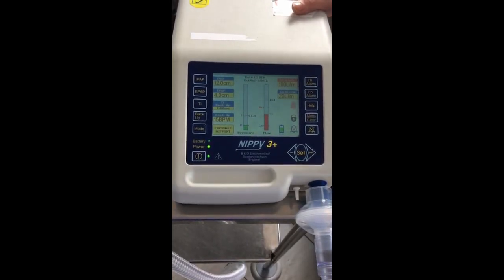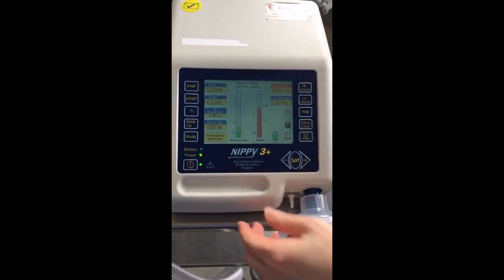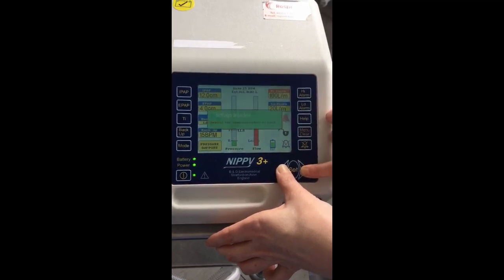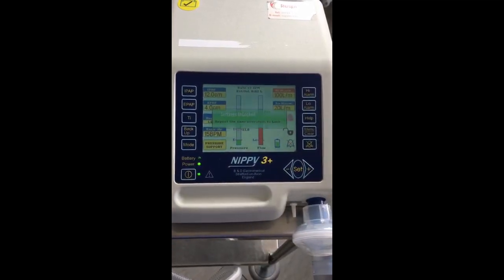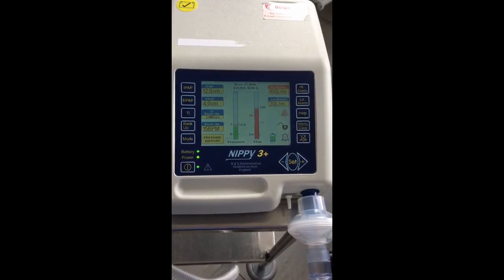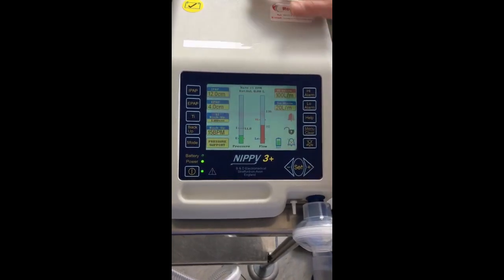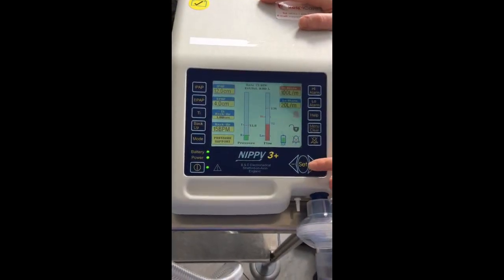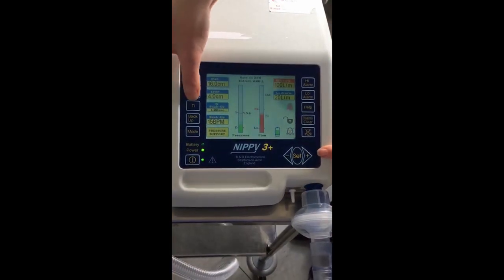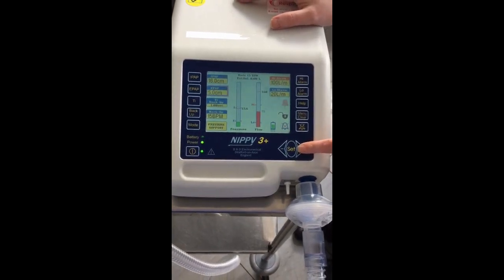The first thing you'll need to do is unlock the machine. There's a lock icon showing the machine is locked. To unlock it, press minus and plus together and hold them down until the lock opens. Now the machine is accessible. For example, if the instruction is to start the patient on an IPAP of 16 and an EPAP of 6: highlight IPAP, press the plus button — it goes up in 0.5 intervals — and go up to 16. Then highlight EPAP and press plus up to 6.